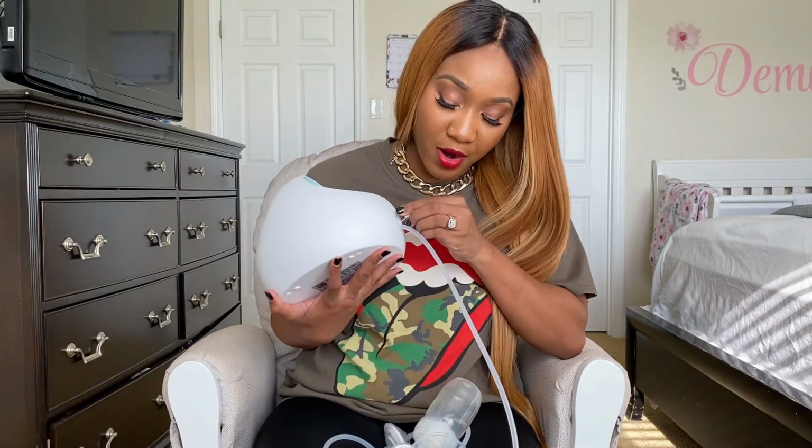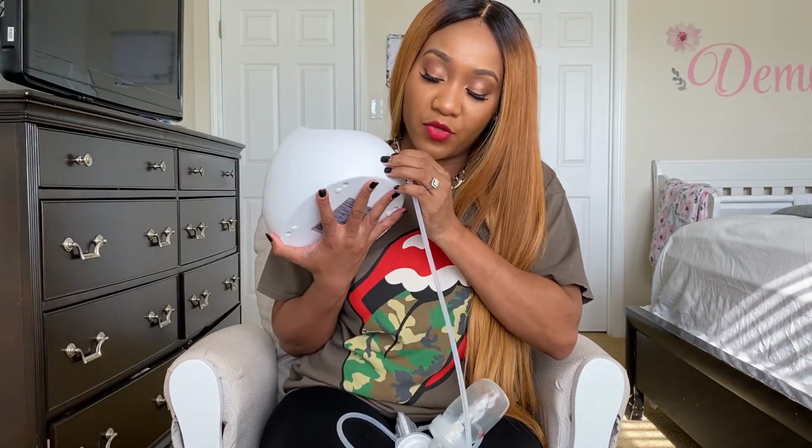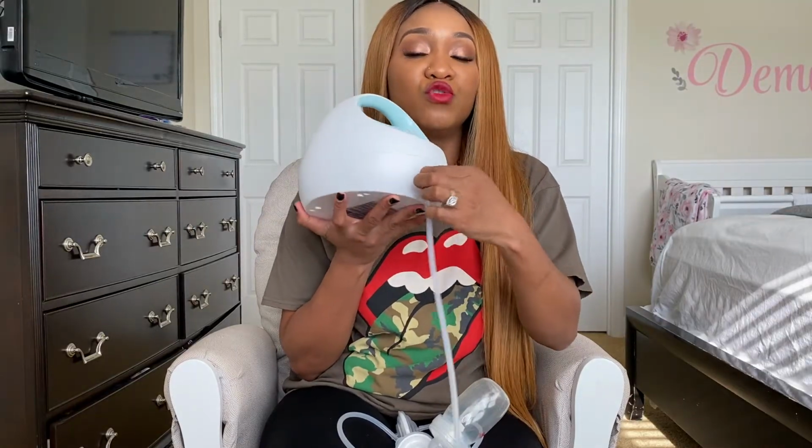So if you're not pumping both boobs at the same time, it is important that you use this little cap on the tubing space that you're not using, because if you don't do that, you're gonna have a very poor suction.